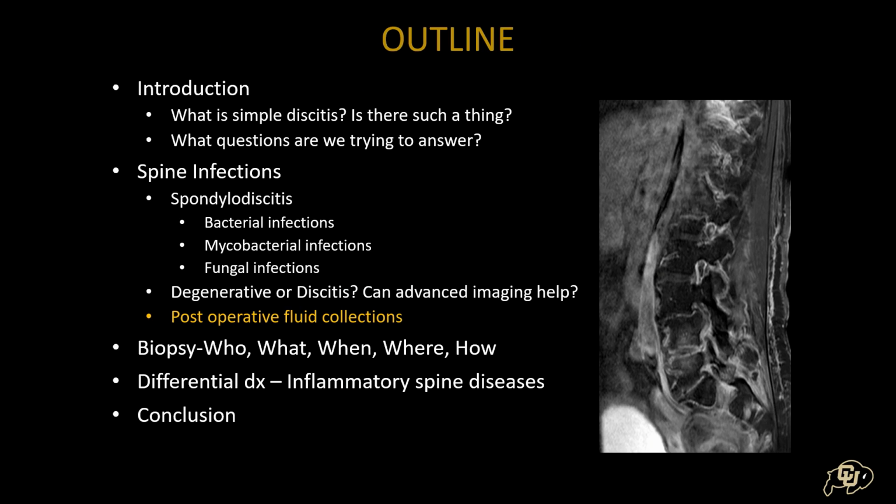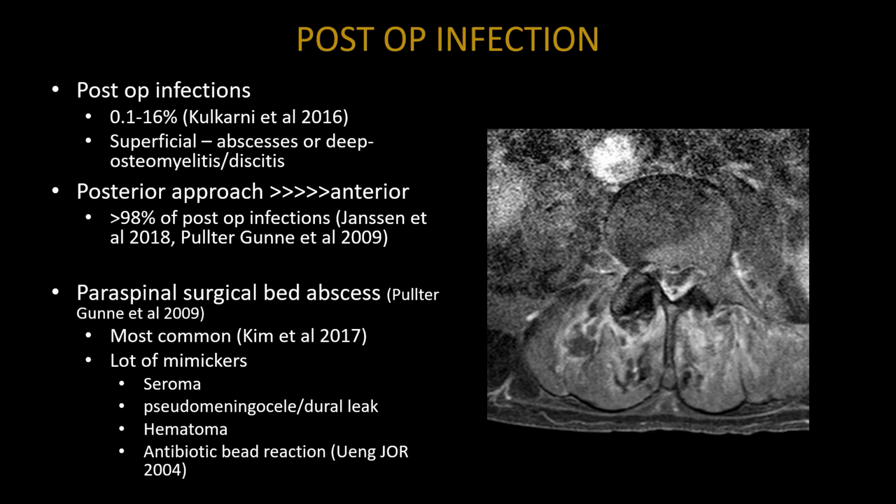Okay, so now I want to talk for just a second about post-operative fluid collections. Now, post-operative spine is, of course, in and of itself an entire lecture, but where I think we really fail is trying to make heads or tails about post-operative fluid collections. I think we can do a lot better.